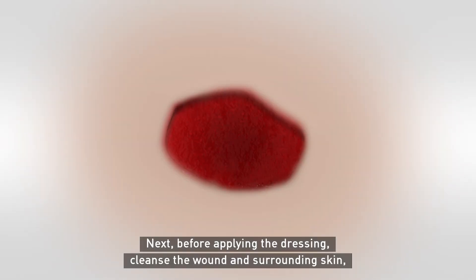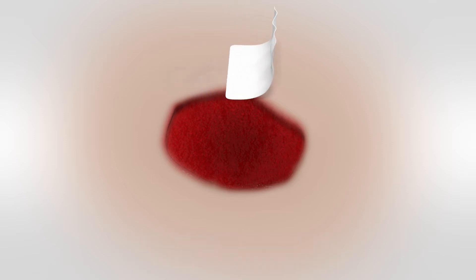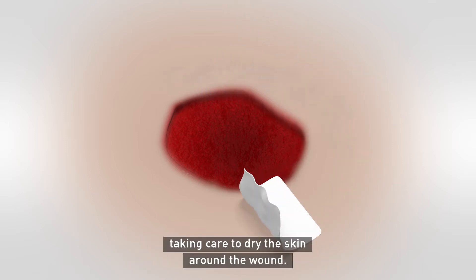Next, before applying the dressing, cleanse the wound and surrounding skin, taking care to dry the skin around the wound.